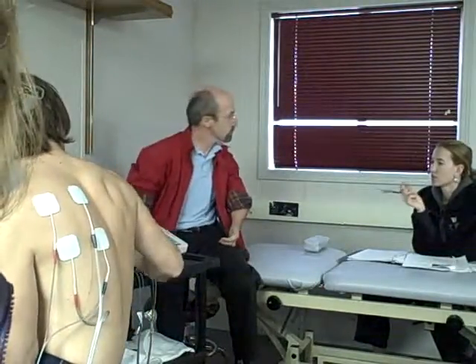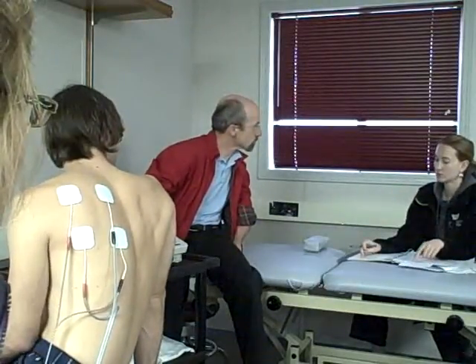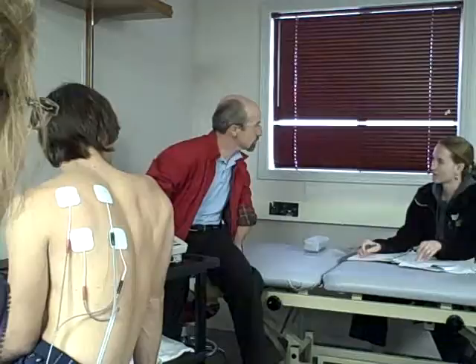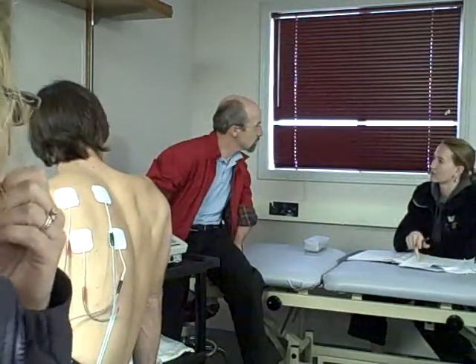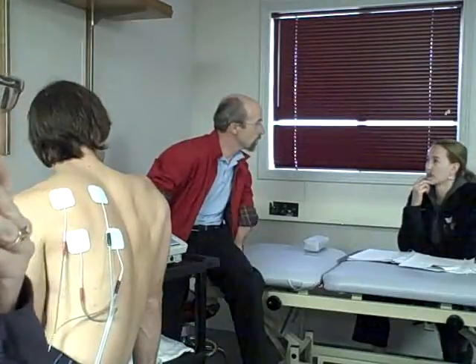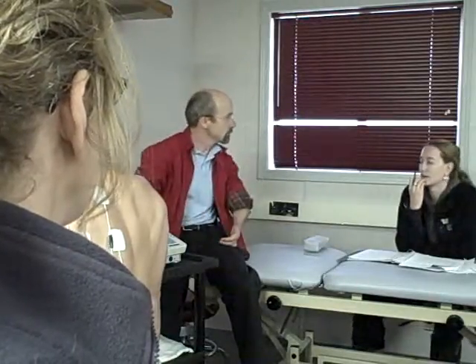The white noise allows stereo. So it's successful for people who want to reduce their pain, not eliminate it. On quad polar, by default, all the machines out there, as soon as I choose quad polar and start raising the intensity, by design, both channels go up together. Same thing. Breaking the pain cycle.